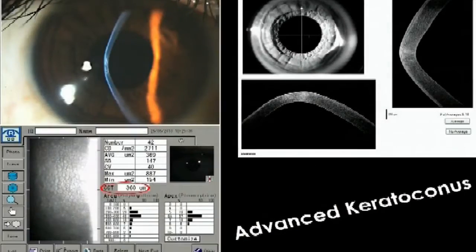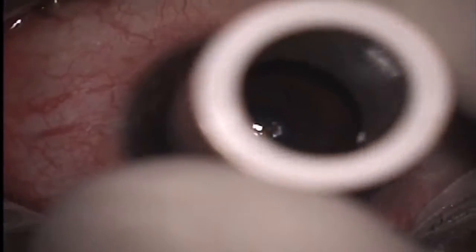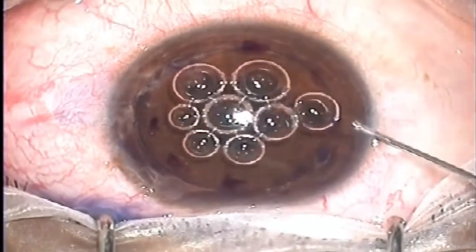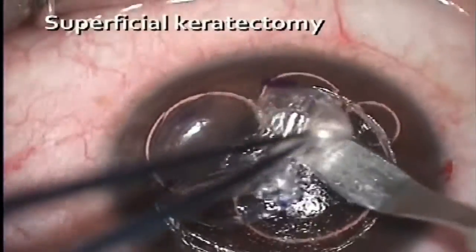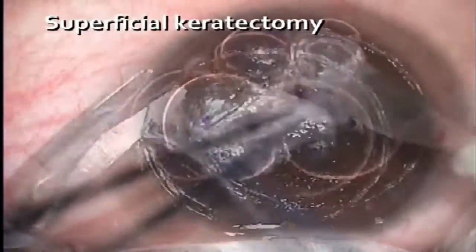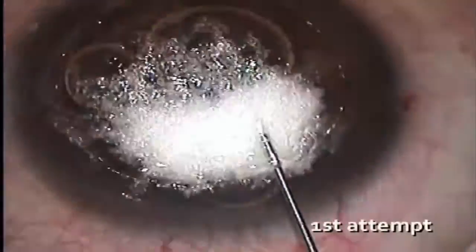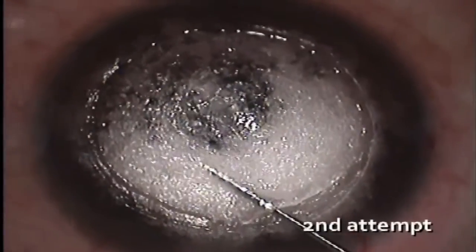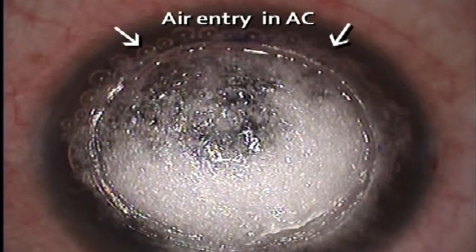Then came the big moment when we tried to implement what we learned in the wet lab in a real-life situation. It was a case of advanced keratoconus, and big bubble DALK was planned. A superficial keratectomy was performed and air was injected, but the big bubble was not achieved. A second attempt at another site also failed, and air entered the anterior chamber.